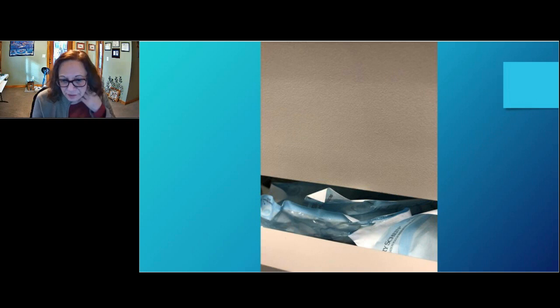One of the issues, I know that a lot of questions I get related to these is that I don't see anything. That, yeah, it was smushed, it was folded over, but it looks fine. My concern has always been not just what you see, but what about what you can't see? You cannot see microorganisms, you cannot see micro tears, and that could be just as deadly to your patient as if there was an overt rip in the package and you used the instrument anyway.